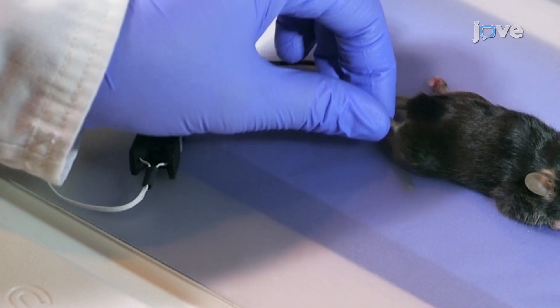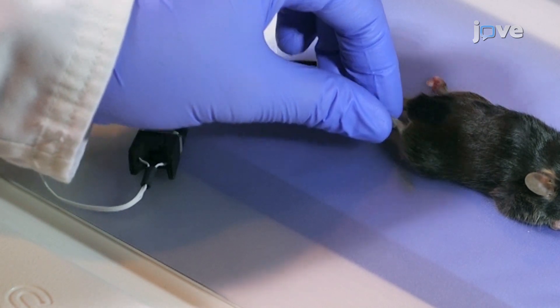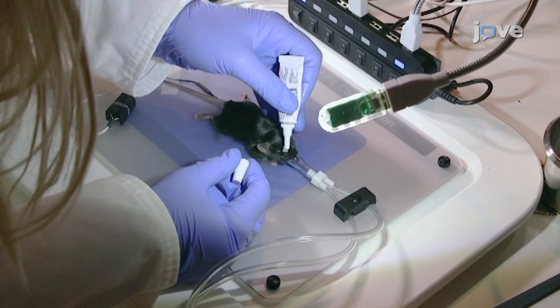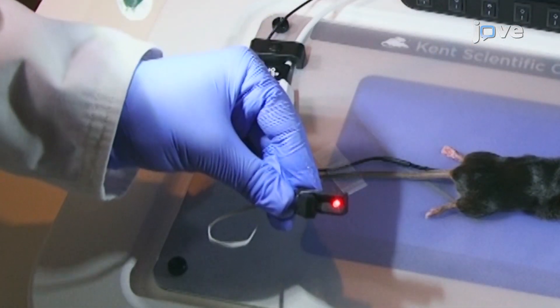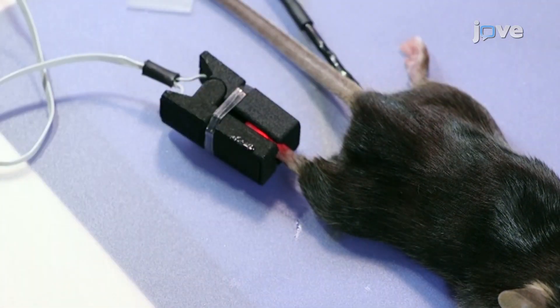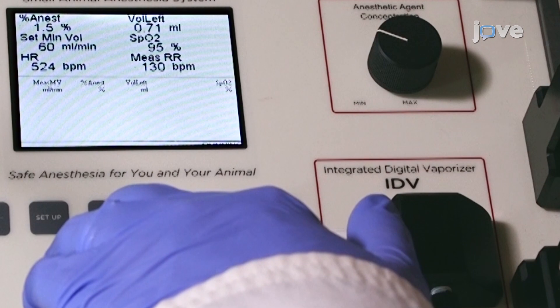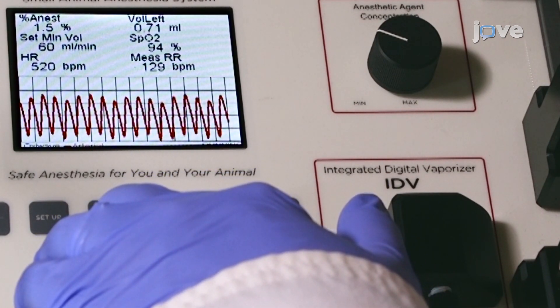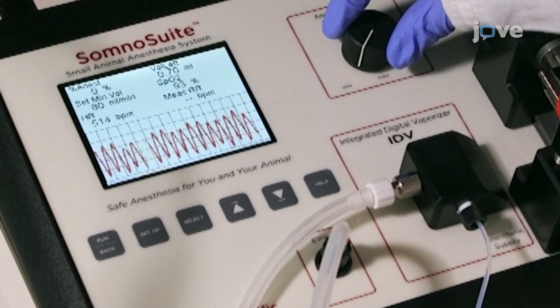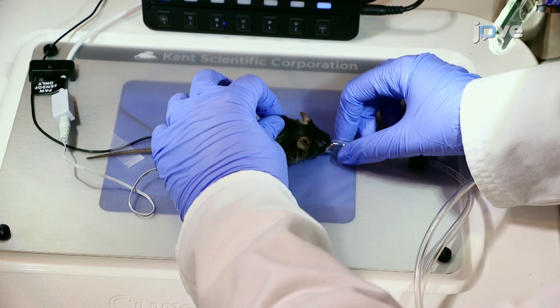Confirm the depth of anesthesia as determined by a lack of withdrawal reflex during an interdigital pinch. Apply ophthalmic ointment to the eyes to prevent dryness during anesthesia. Begin physiological monitoring by placing the sensor over the pad of the hind paw. Position the sensor so that the red light illuminates the paw. Display the pleth wave in order to visualize the sensor signal.